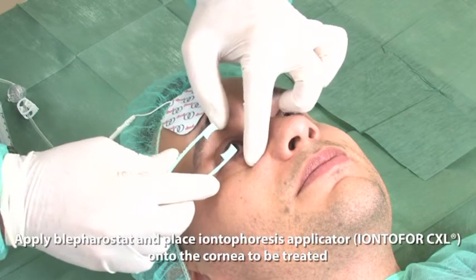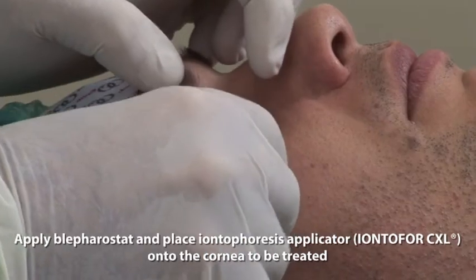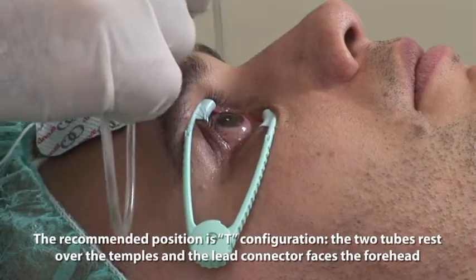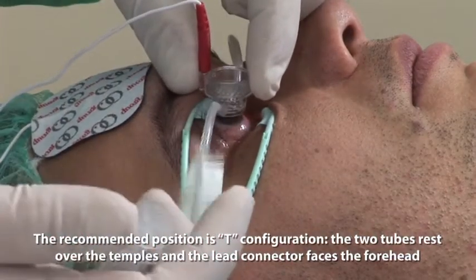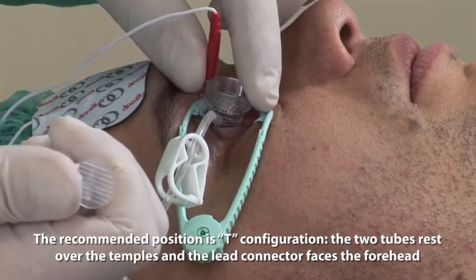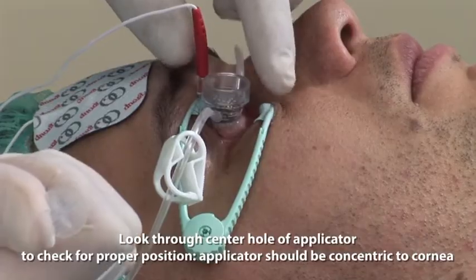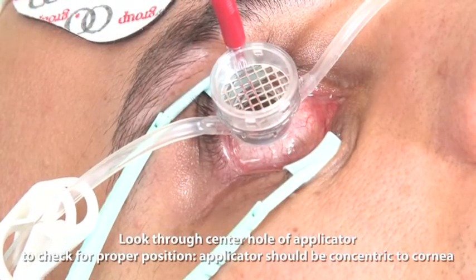Apply blepharostat and place the Iontophoresis applicator IONTOFOR CXL onto the cornea to be treated. The recommended position is a T configuration: the two tubes rest over the temples and the lead connector faces the forehead. Look through the center hole of the applicator to check for proper position. The applicator should be concentric to the cornea.